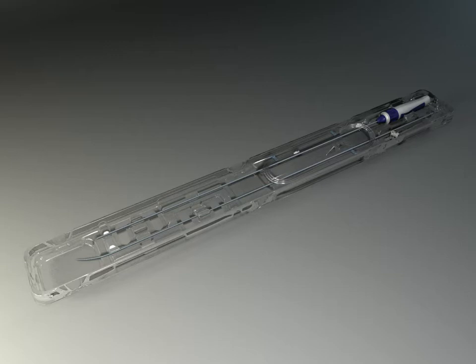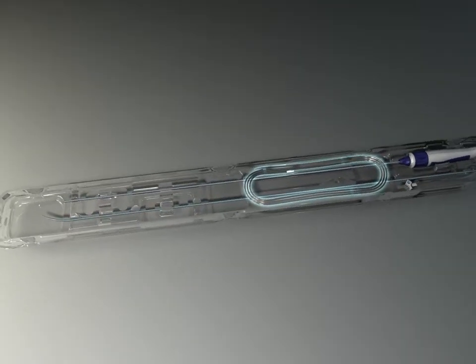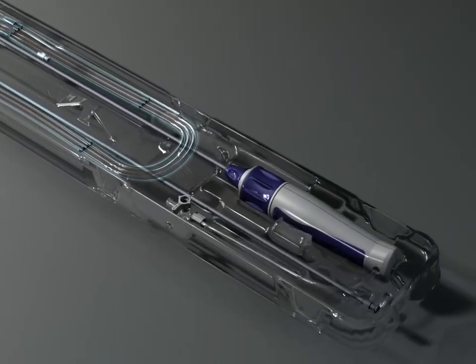The HeartSpan kit includes an 8.5 French steerable sheath, a tapered dilator designed to conform to the inner diameter of the sheath, and an 0.032 by 180 centimeter guide wire.